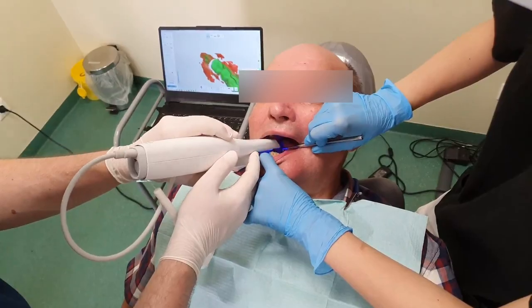Here is a new beautiful piece of software that will first help us build orthodontic models and simple models, and in time we'll get single dies and many more other features that we all will be able to enjoy in the future.